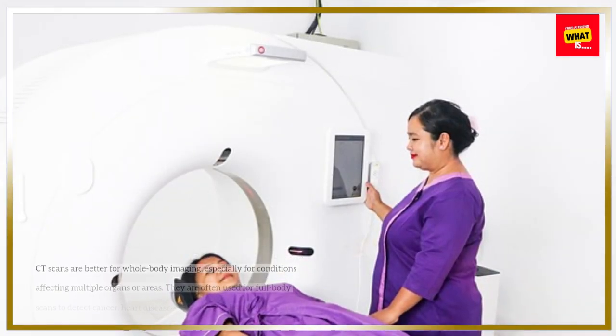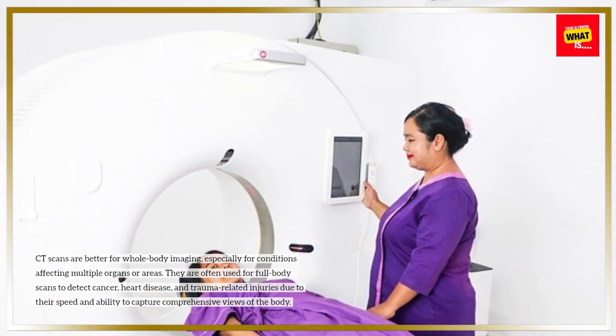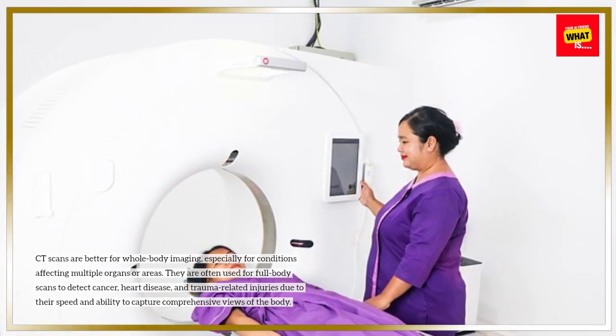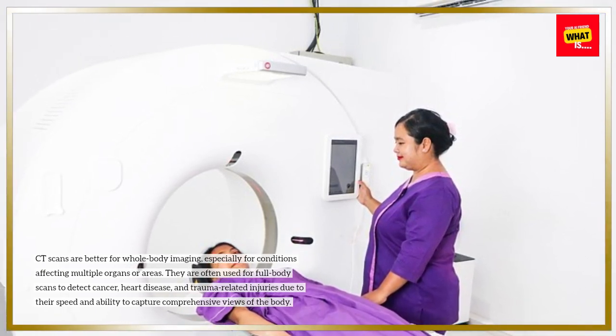CT scans are better for whole-body imaging, especially for conditions affecting multiple organs or areas. They are often used for full-body scans to detect cancer, heart disease, and trauma-related injuries due to their speed and ability to capture comprehensive views of the body.